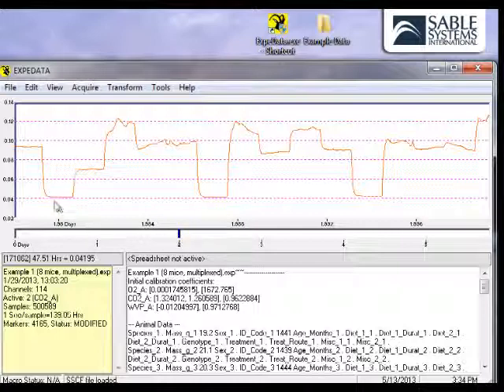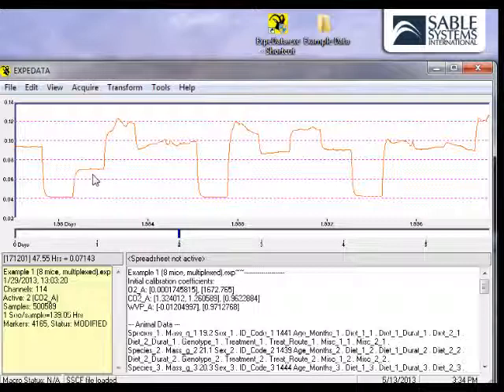By the way, the switching from cage to cage or from baseline to cage can take place in as little as 15 seconds, which gives the Prometheon multiplex system of any size a cycle time that can be as low as two minutes.